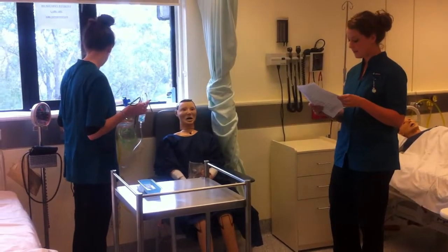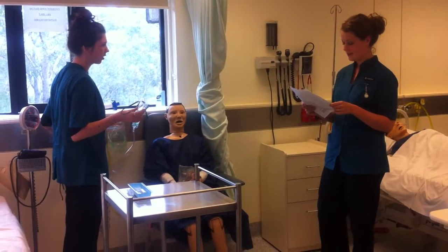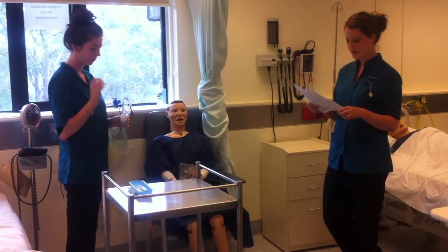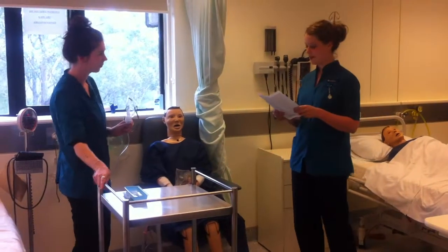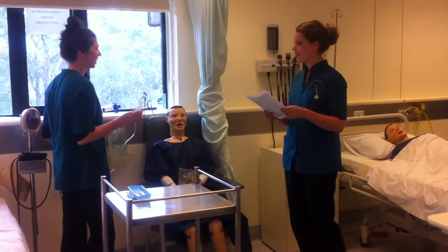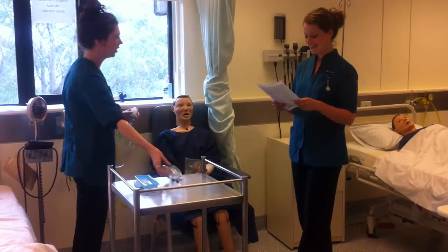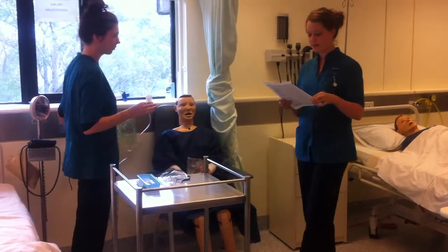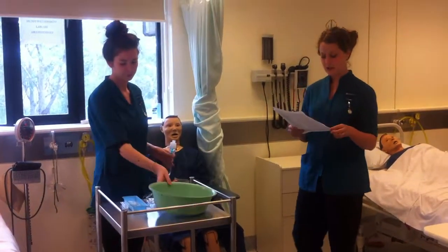Penny will disconnect the nebulizer from the tubing. And we'll use the compressor for a short period to clear any moisture in the tubing. This is to reduce any potential risk of bacterial contamination if moisture remains in the tubing.